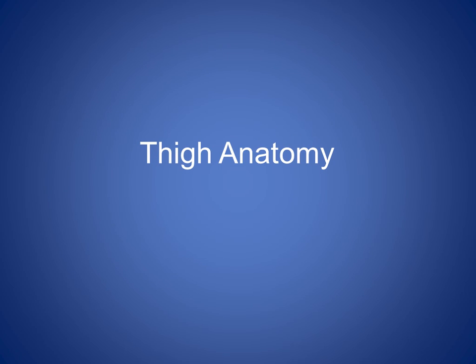We know that the thigh is a rather large anatomic structure, and when you evaluate the thigh with this relatively small probe, it's easy to get lost. Typically at our place, we get a request to evaluate a thigh lesion. The tech drops a probe on, marks something in a muscle, around a muscle, and you stroll into my office and say, here, Dr. Lance, you look at this, and I see this lesion in the muscle. And I'm like, well, what muscle is that? I don't know.